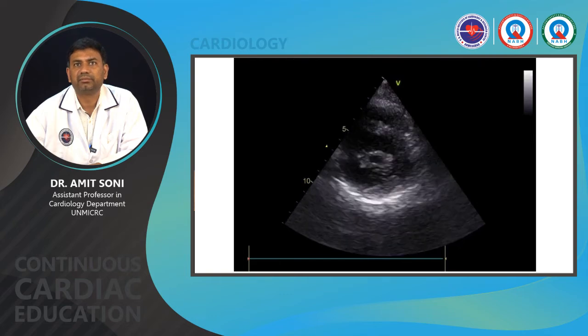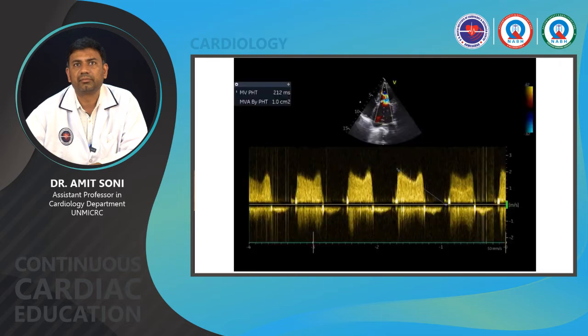This is classically mitral stenosis, and this is how we calculate the pressure half time.